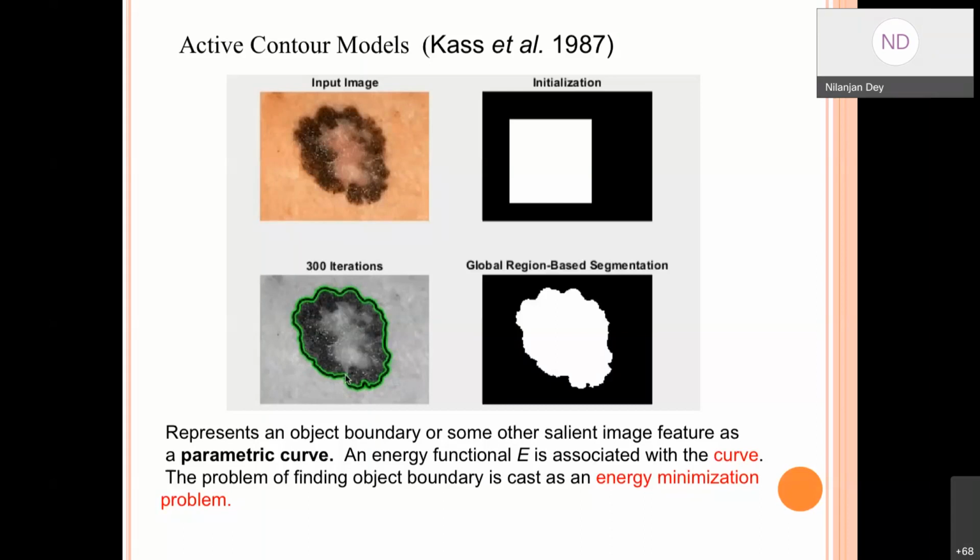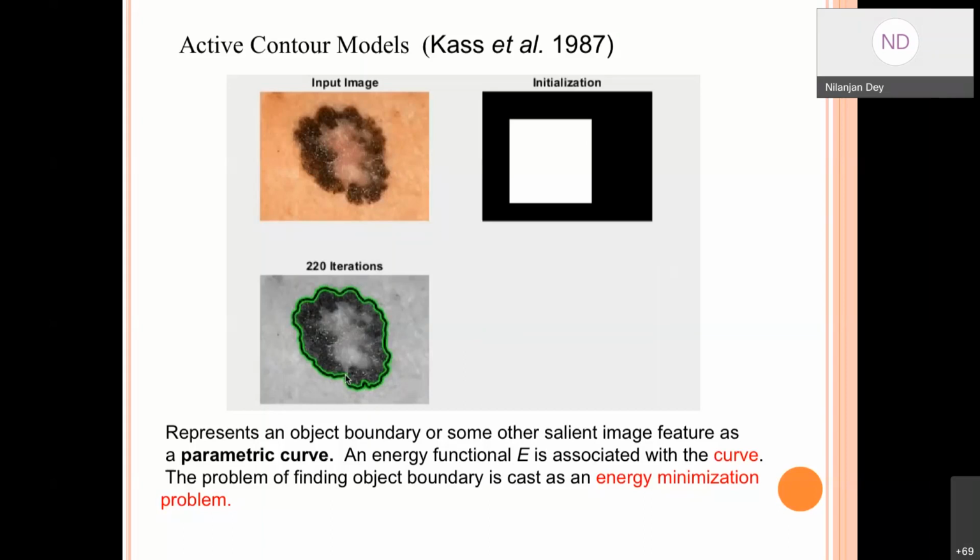Okay, so the algorithms are infused, and people started deploying them into different modalities, and different machine learning frameworks give various results, and ultimately the work is published. This is how we tried to do it long back, but now the things are different. It's not only segmentation; we are actually trying to avoid segmentation, because all these segmentations have their own limitations.